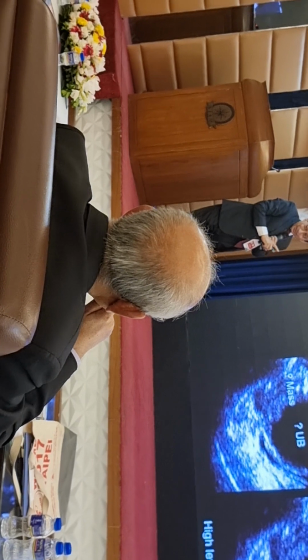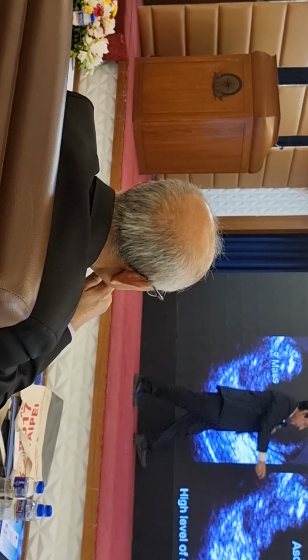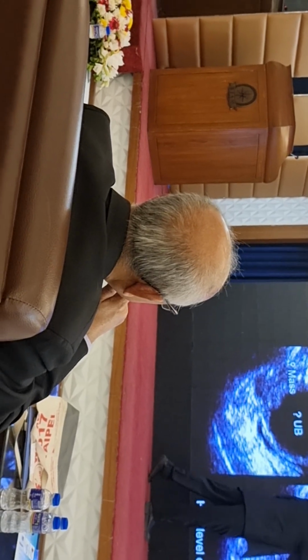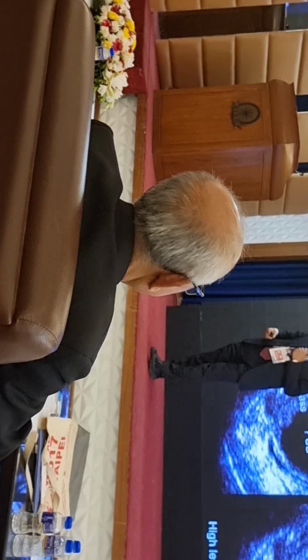But actually that is not mass. And this one is not urinary bladder. This is a slit, slit-like space. This is urinary bladder. And this is ascites.